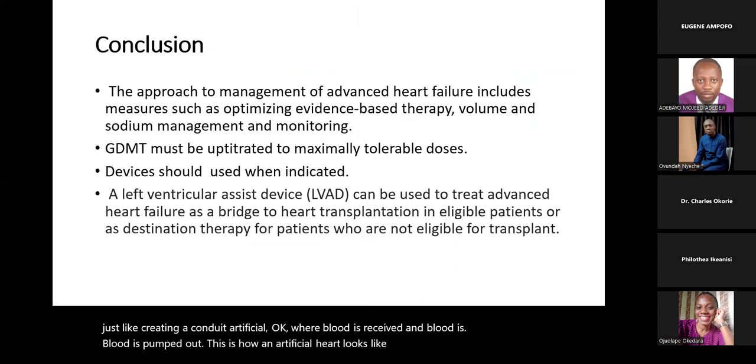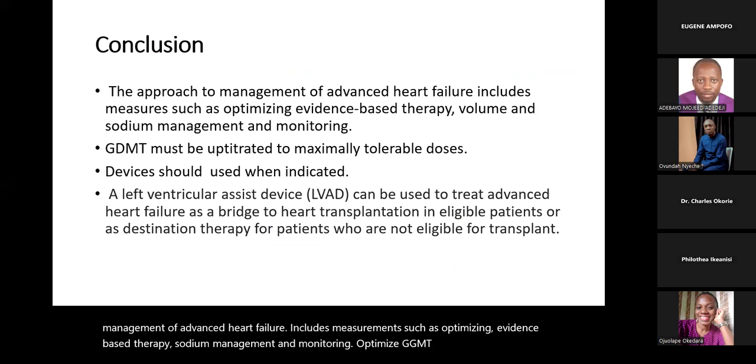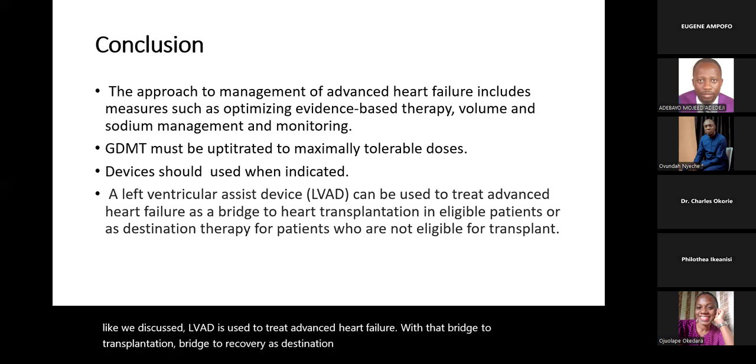Conclusion: the approach to management of advanced heart failure includes measures such as optimizing evidence-based therapy, sodium management and monitoring, optimizing GDMT and devices. And of course, like we discussed, LVAD is used to treat advanced heart failure, either as bridge to transplantation, bridge to recovery, or as destination therapy in patients who are not eligible for transplant.